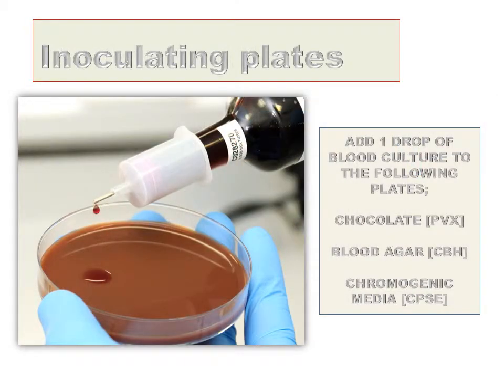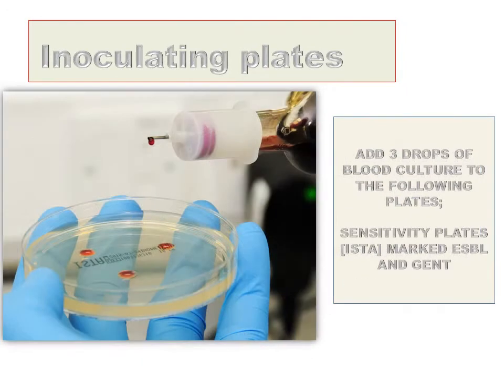Dispense one drop of blood culture to the following plates: the chocolate, blood agar and chromogenic media. If more than one drop is dispensed this does not matter. To the two sensitivity plates marked ESBL and gent, add three drops of blood culture. If more are added this does not matter, but three is ideal.